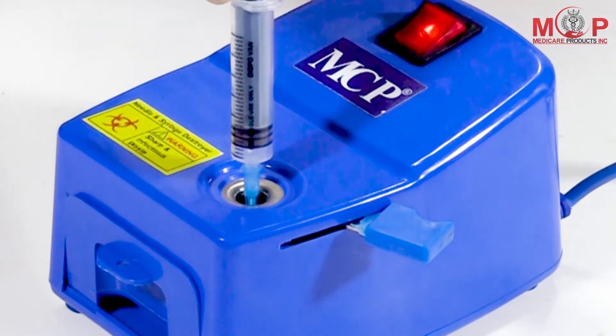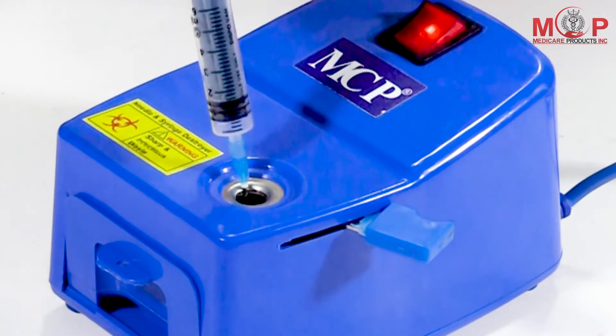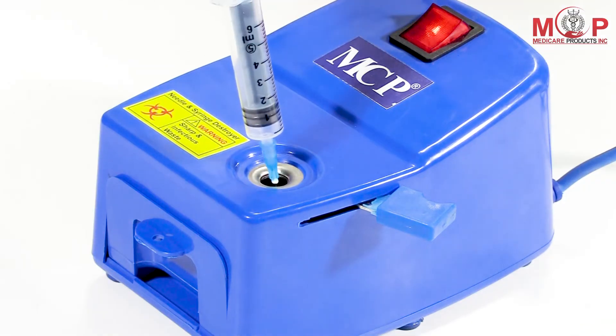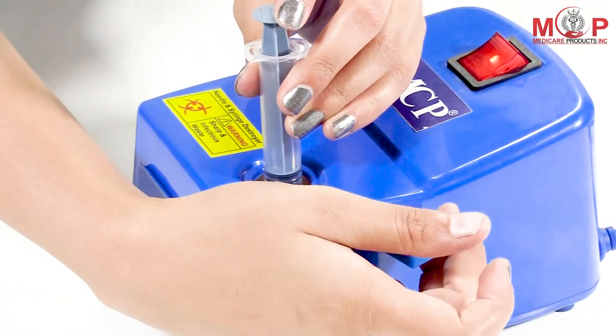Push it gently downward till the sparking stops completely. Then again put the syringe in the slot and pull the handle blade downwards.